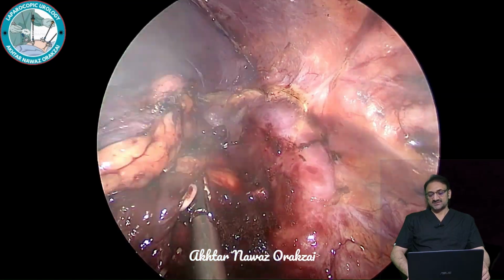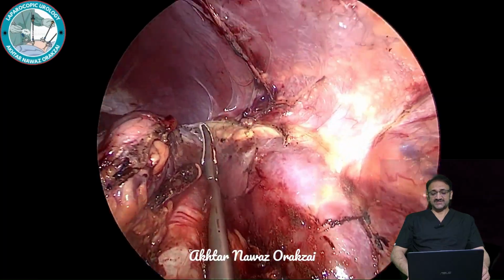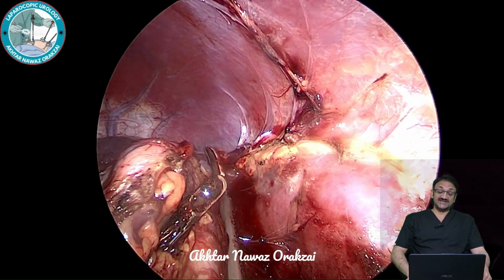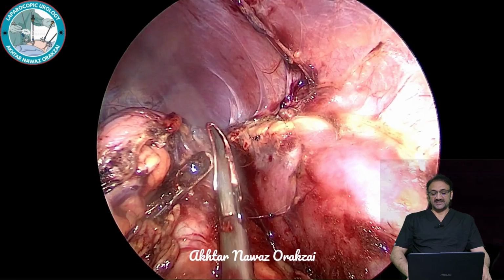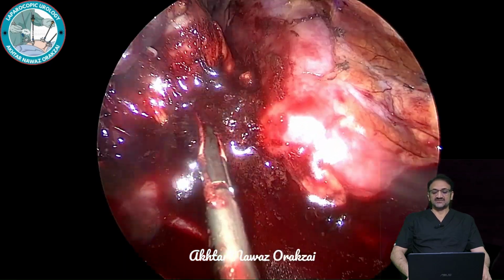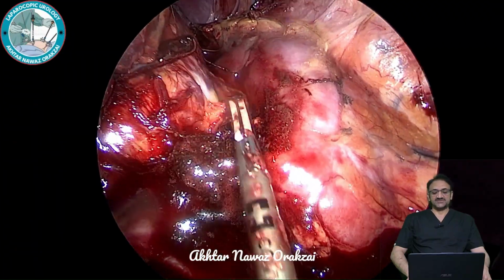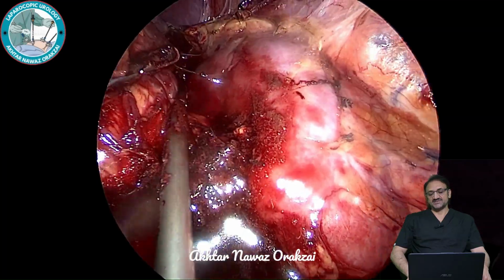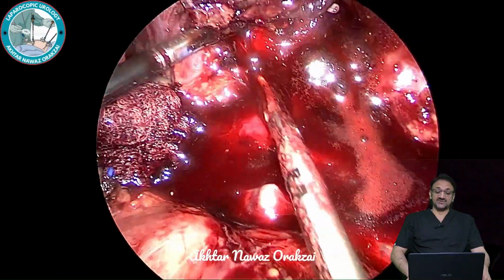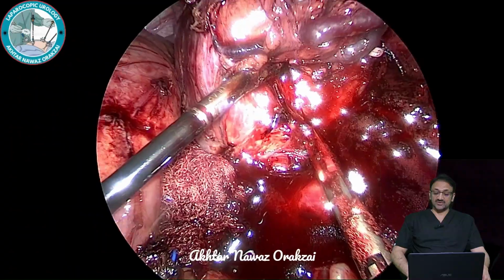So what we have done is that still the pressure is low, as there is no significant bleed, but we have informed the anesthetist that he should be having blood at hand, because we may encounter some bleeding. While we were performing this procedure, me and my team discussed that let's start the procedure laparoscopically, and then during the procedure we will decide whether we should continue laparoscopically or convert it.